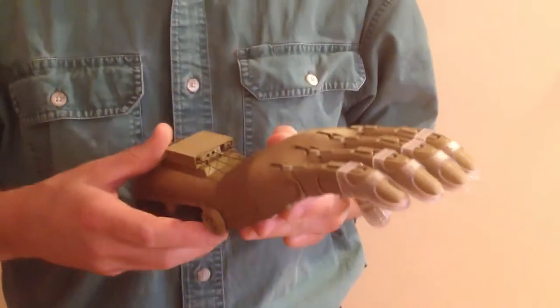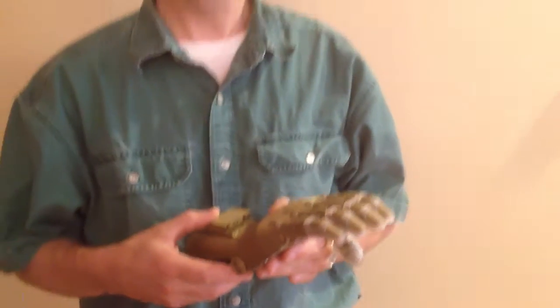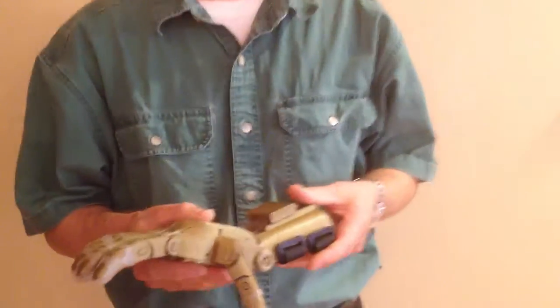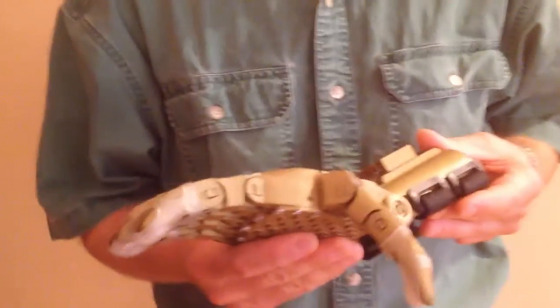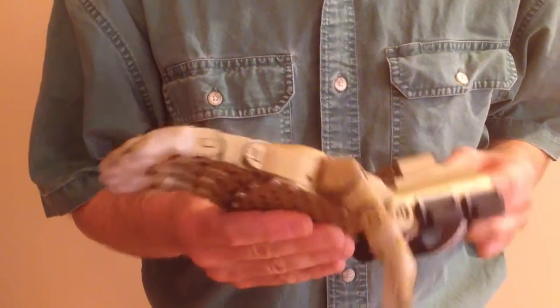I've been involved in several build events where we've had multiple people building hands, and at the end the hands quite often need a bit of adjustment — they aren't all perfect. This is the sort of procedure you can go through to assess the quality and just tweak the things that need improving. First of all, with a hand, one of the most obvious things to assess is that none of the parts are obviously broken.